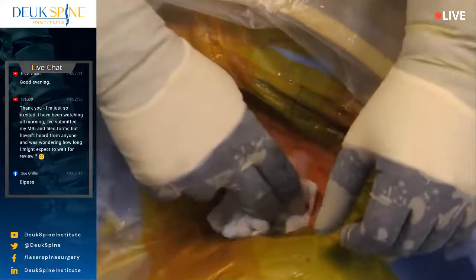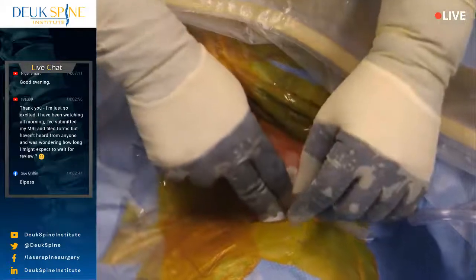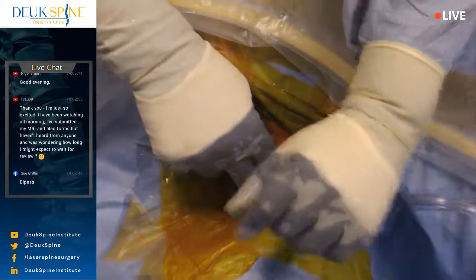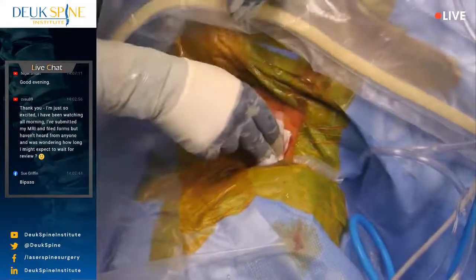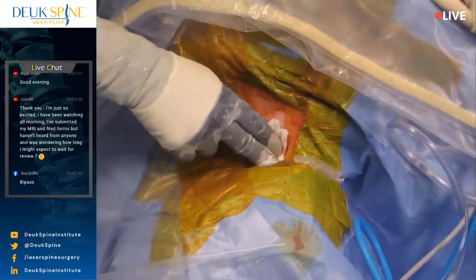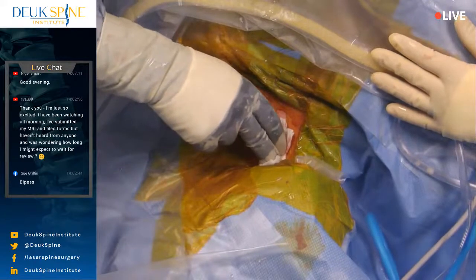I'm going to apply pressure for another minute. Just have a little bit of venous bleeding. Not a big deal, and then I'll show you. But her chin is right here. Her face is here. She has a tube coming out of her mouth, and she's asleep. How's blood pressure? Good? Coming up now. It looks good. 90s. That's fine. She's not hypertensive. She started at 100. All right.